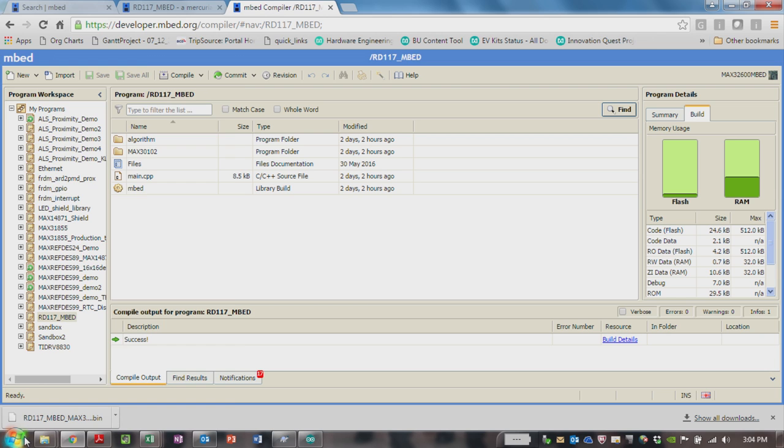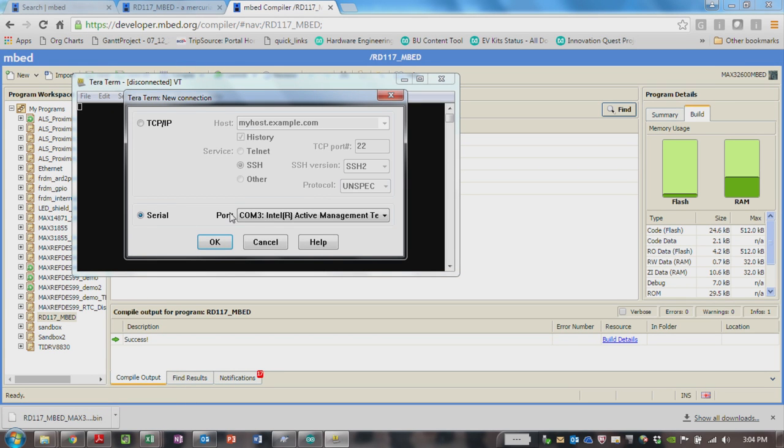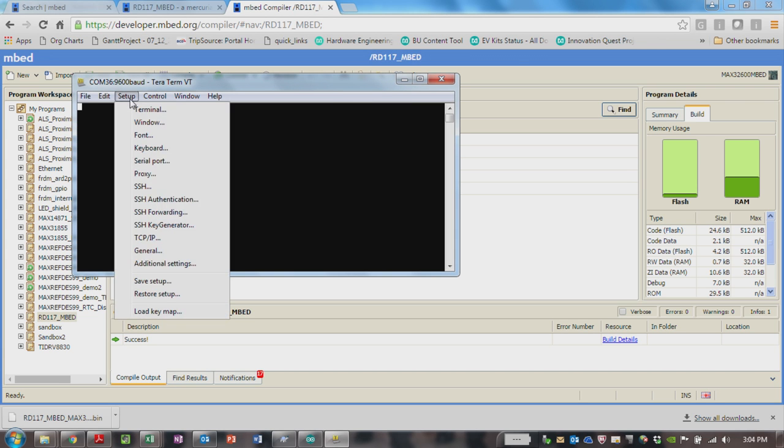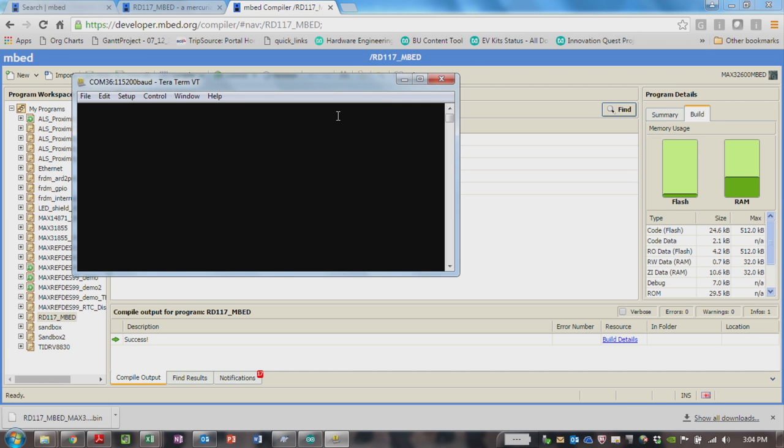So then we'll go ahead and pull up our terminal program here and set the serial port to, it's coming up as 36 for me, and set up our serial communication speed, baud rate of 115K, right? Yes, 115K. Okay. So we'll go ahead and do that. And it says press any key to start conversion. So I think we're kind of in the same space we were before, right?